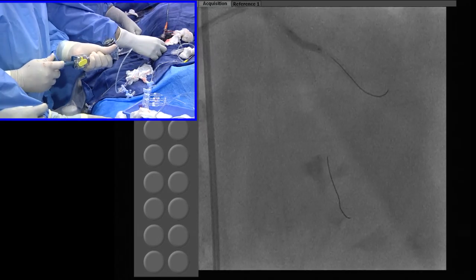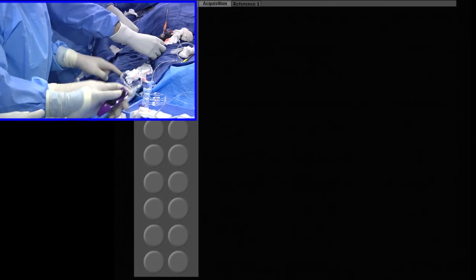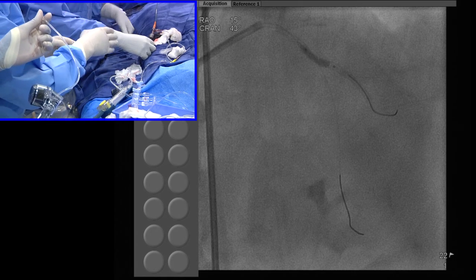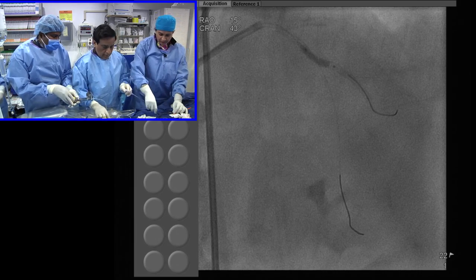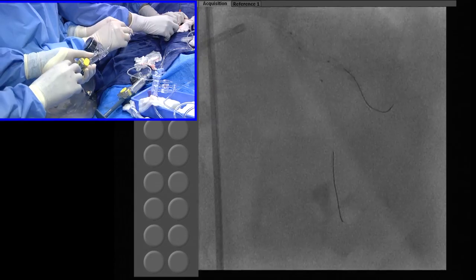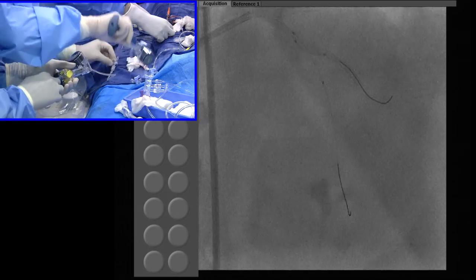Yeah, this is open nicely. You want to put a balloon kissing. You have to put this one too. Why kiss? Because the strut will be impinged now. Remember, we have opened the strut which will impinge. This one, low pressure. Go, kissing. So basically, the key. Yeah, good. So remember what happened is 2.5, you had to do a kissing, BVS, so that 2.5. Go up.